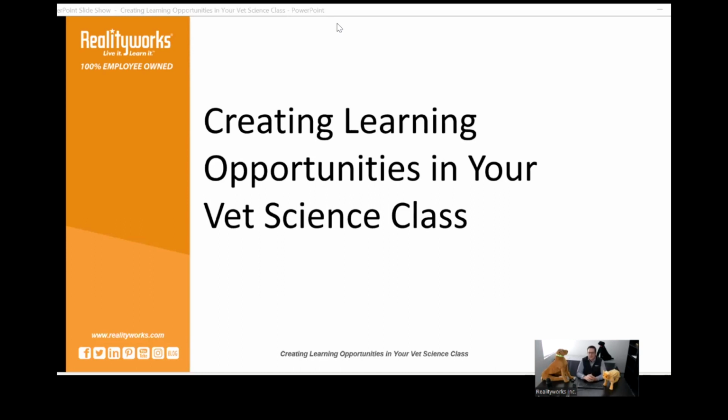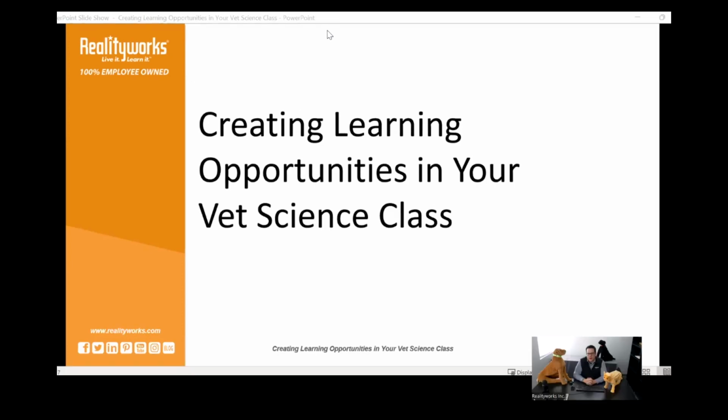I am here with our vet science class of animals. We are excited to talk about them. Some of you may know about our product, our canine vet trainer, which is behind me here, our black lab that we brought out over a year ago. It is a great tool to use in your classroom for getting students to understand those learning processes within vet science and some of the great techniques that you can learn with it.